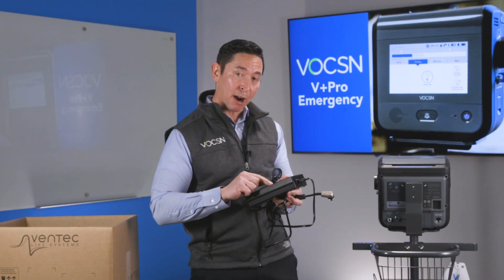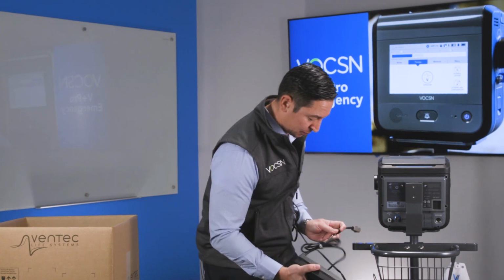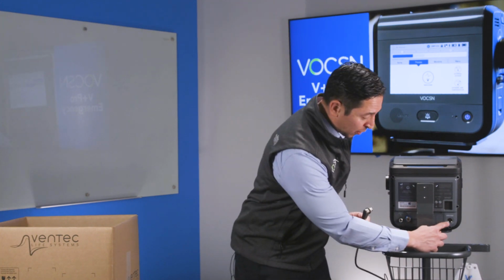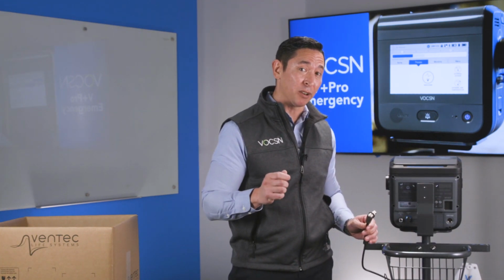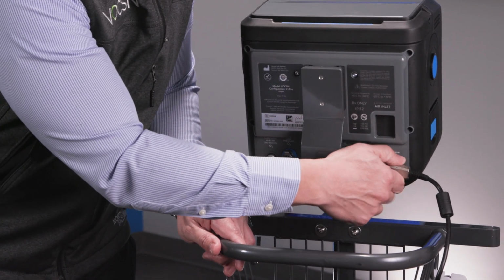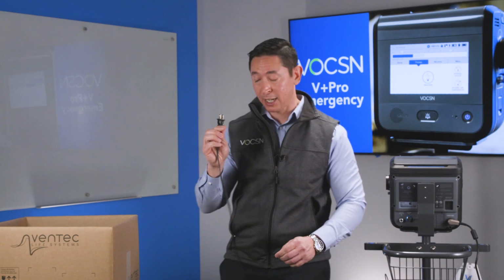So I'm going to set this big power brick on a tray down here. And then I'm going to connect this other piece on the port right there. And it goes in at a 90 degree angle and it threads in for security. And then I'm going to connect to my wall outlet.